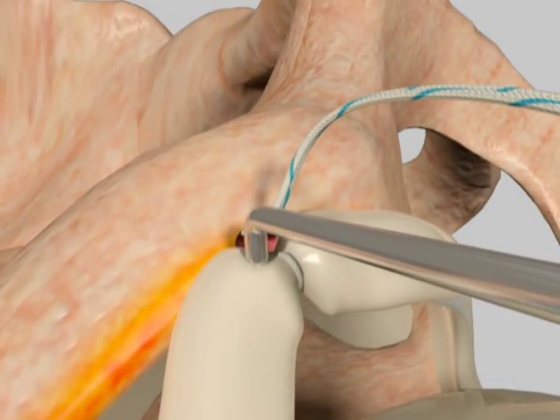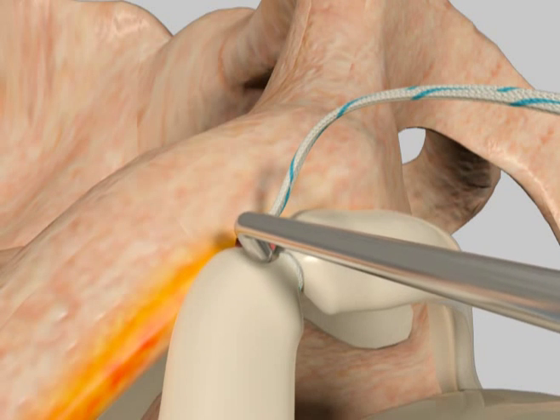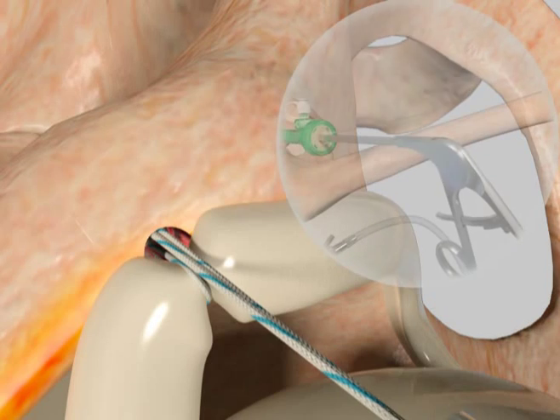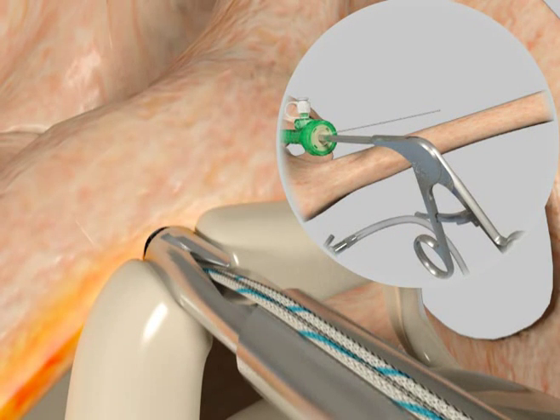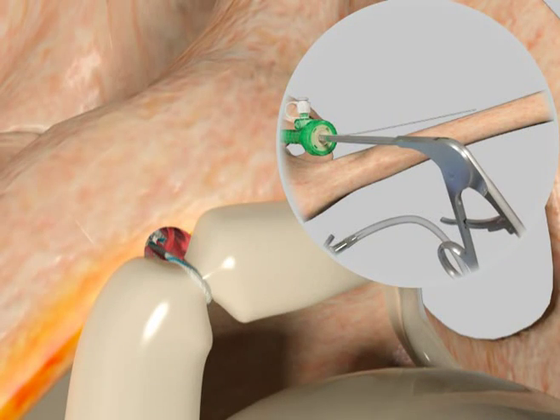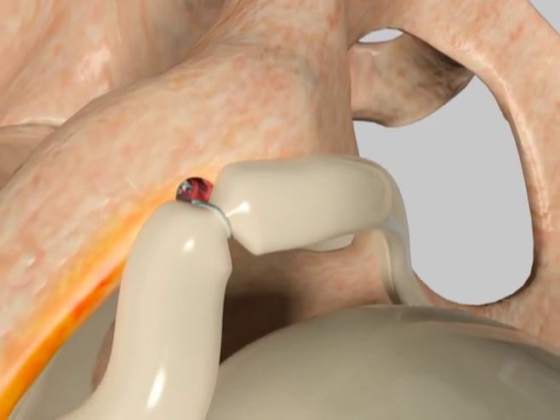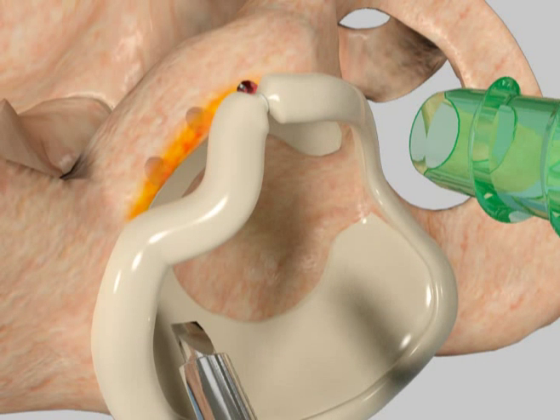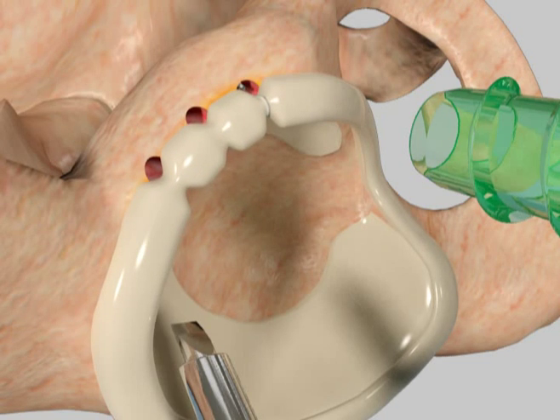Probe the labrum to verify the proper repair is obtained. Then cut the suture limbs to complete the first anchor repair. Repeat with additional anchors until the desired repair is obtained.